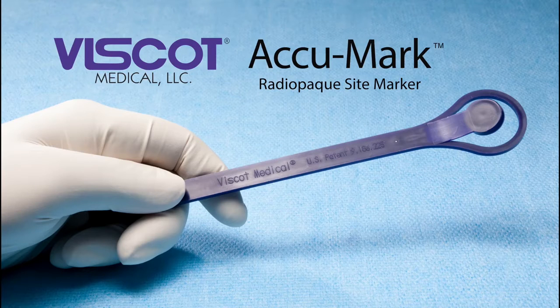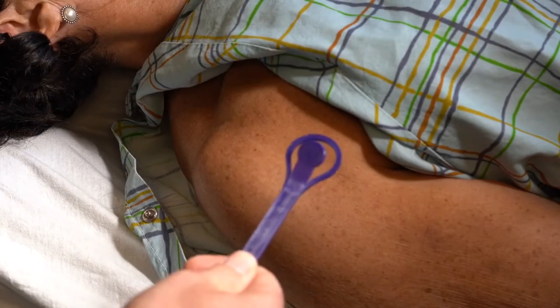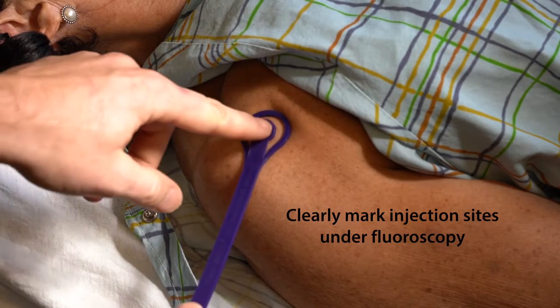Viscot Medical, the global leader in surgical site marking, introduces the Acumark — a device designed to precisely locate and clearly mark injection sites under fluoroscopy.